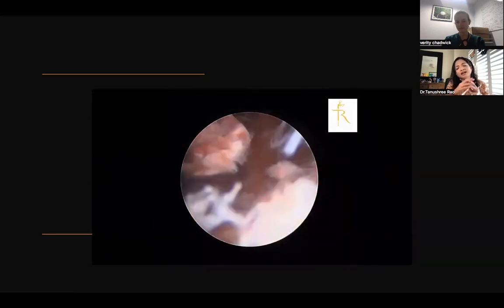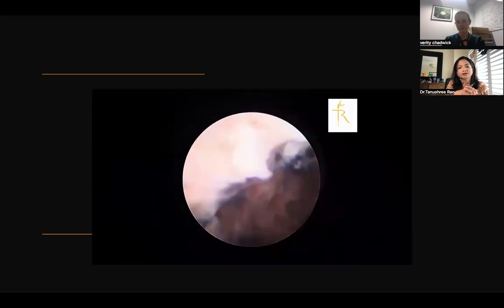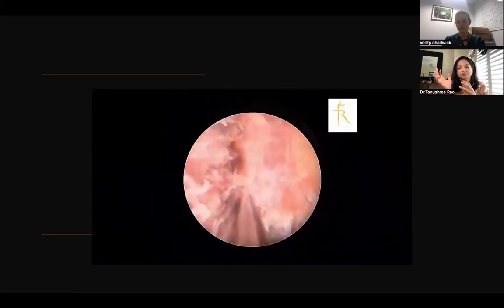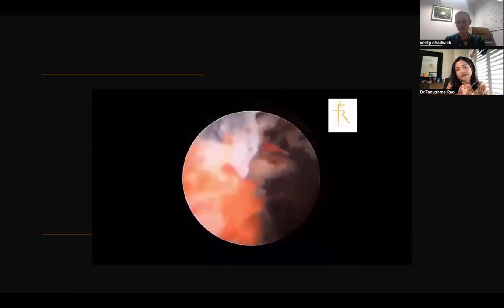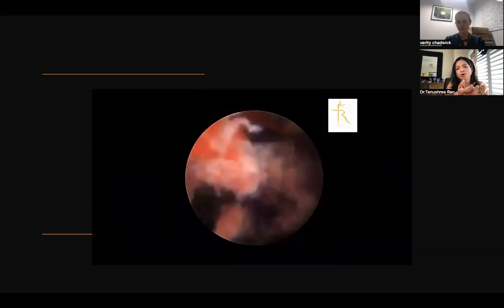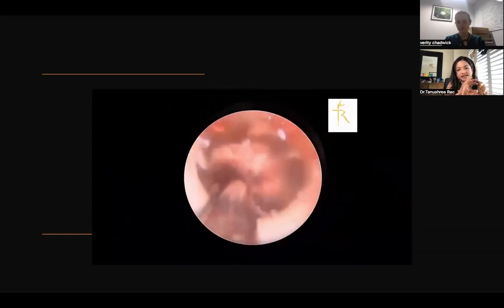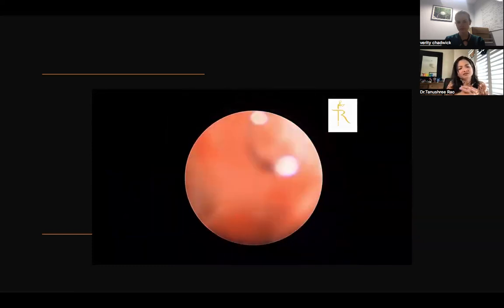Instead, I think this is an improvement for all of us, where we get to stay in one spot and take out all the tissue without it obscuring the view. So you can see that this is a huge polypoid growth of sorts. And I'm just using this resection system all over. It was quite big, to be honest, around 5 centimeters or so.